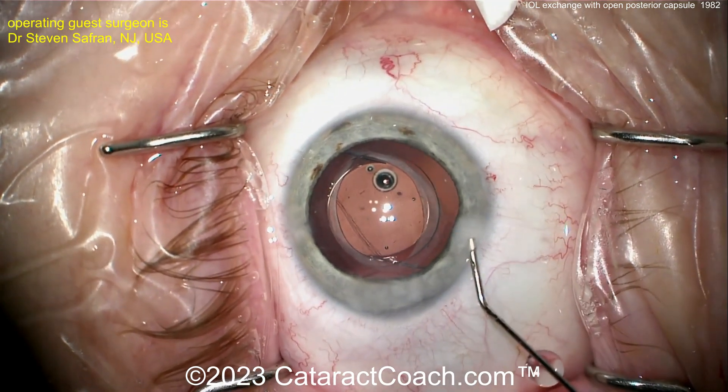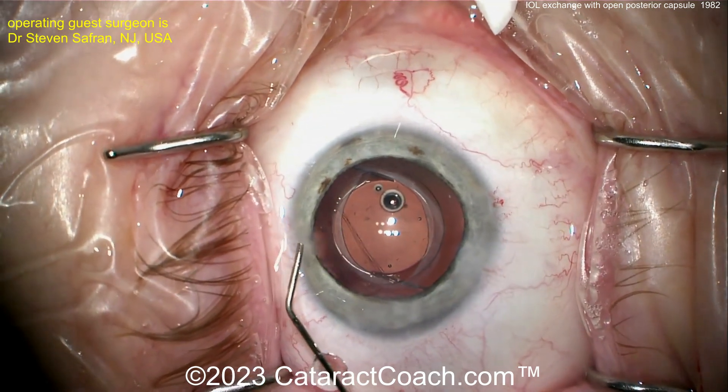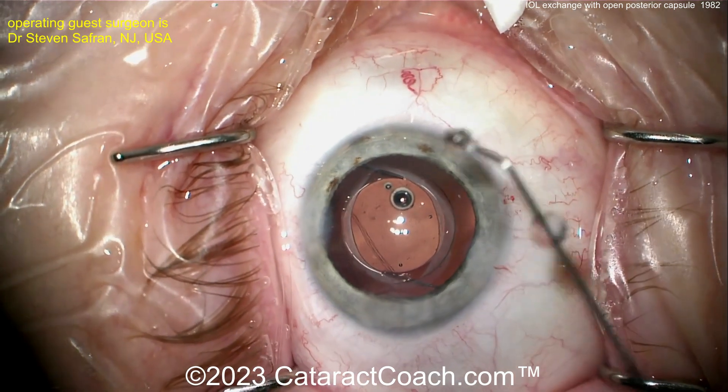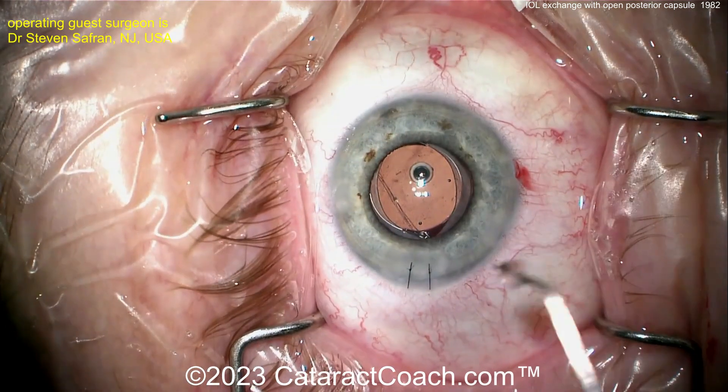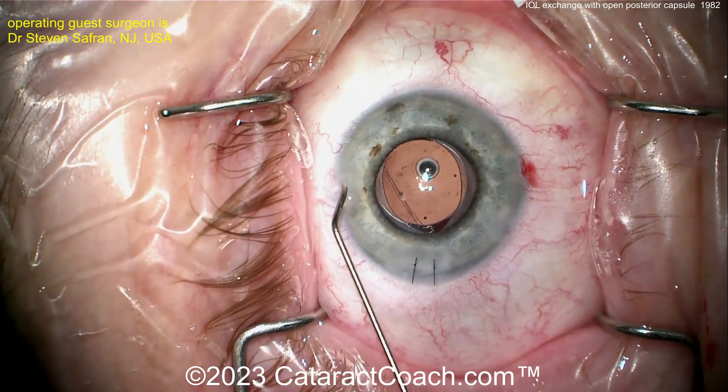At the end of the case, the incision is sealed up. The large main incision will likely need one or two sutures to ensure it's completely watertight and astigmatically neutral. Dr. Saffron reports the patient had a beautiful outcome.